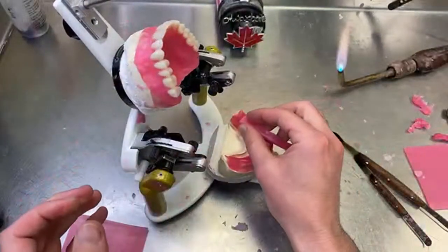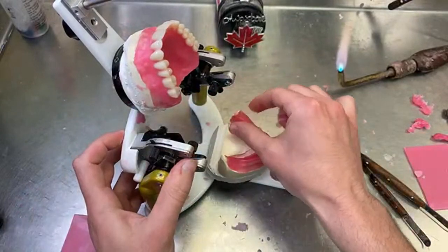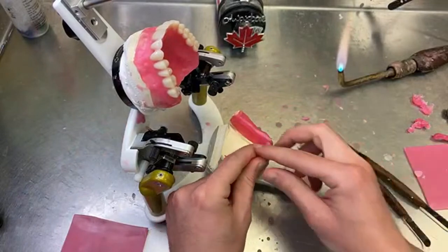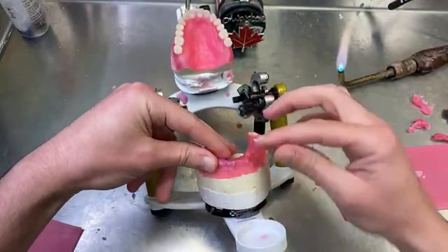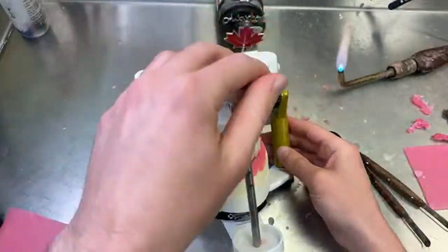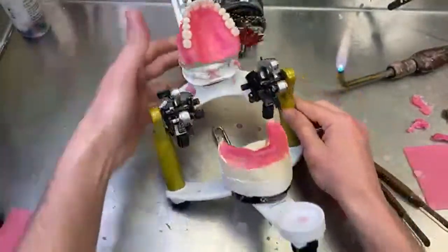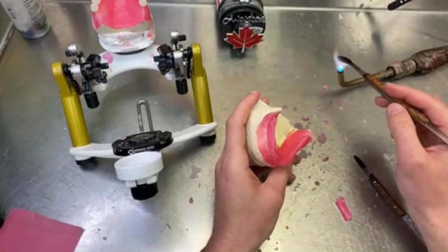Okay, so probably don't need that much here. I'm just gonna put a little bit of wax and that's your setup. Wax bite. Because when I looked at it that way, see, it's a little too close. So I'm gonna put it all together.